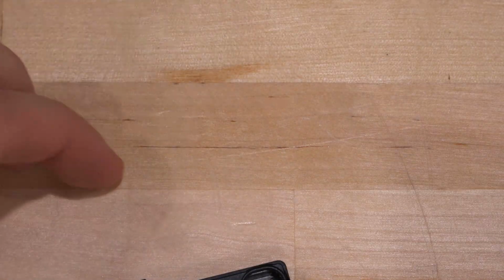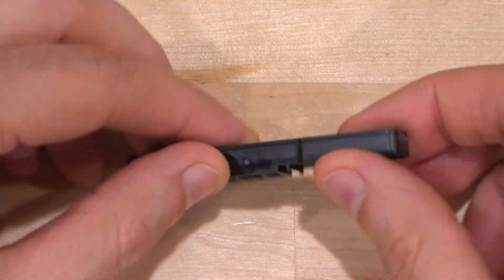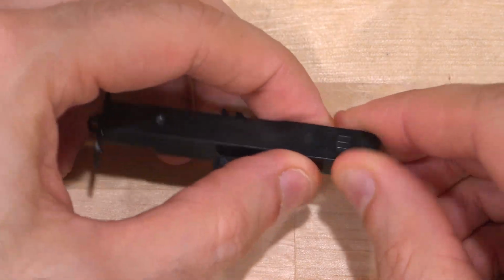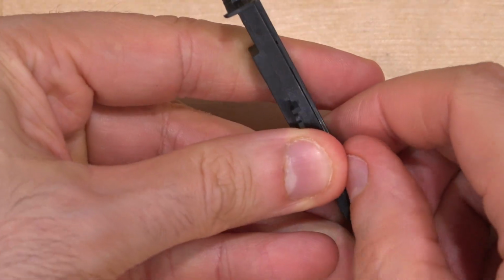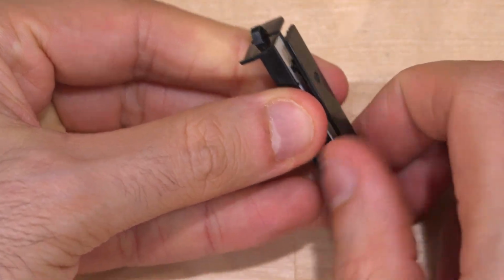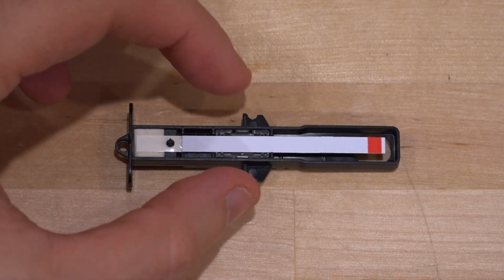And I think that this thing opens up further. We should be able to remove the strip, I think. I think this looks like it's in two pieces. Let me see, can I remove this? I think you should be able to remove it. Oh, there we go, I got it. There it is. Oh, look at that, there's our strip.